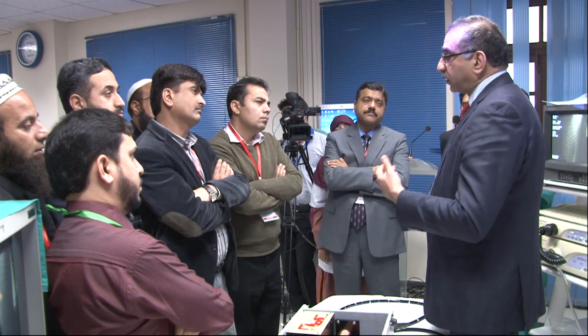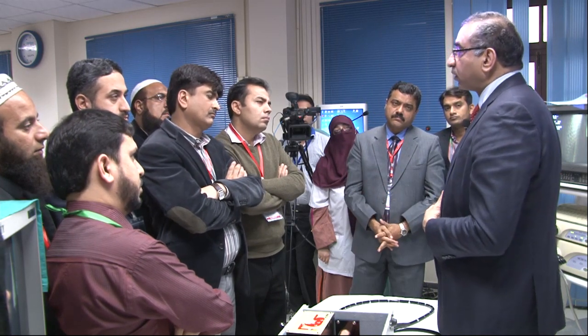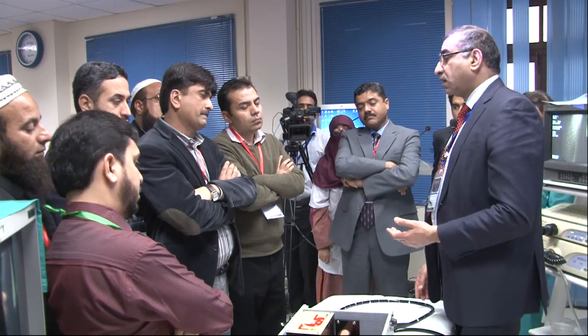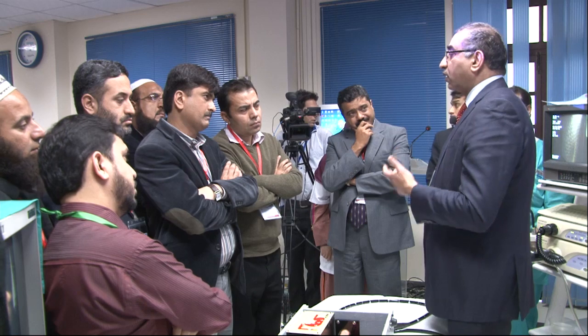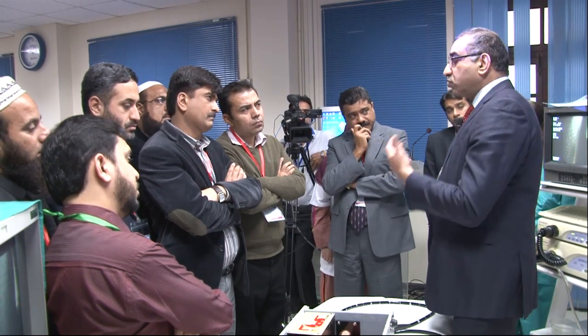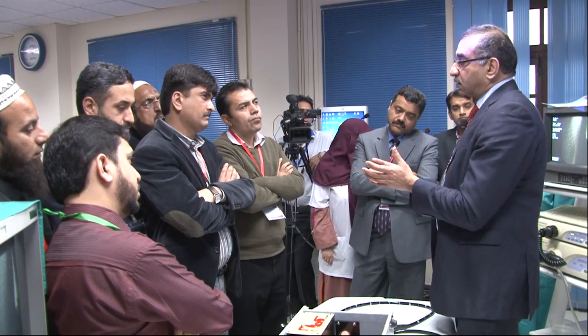But if you have difficulty traversing the stomach, then the recommendation is that you give buscopan when you get into the duodenum. It will take about a minute or so for it to work. If your visibility is not good, I strongly recommend that you use Infacol spray, because it will break up the bubbles for you, and because you need to have a good visual on the papilla to cannulate.